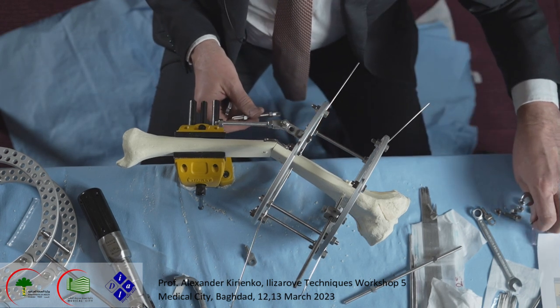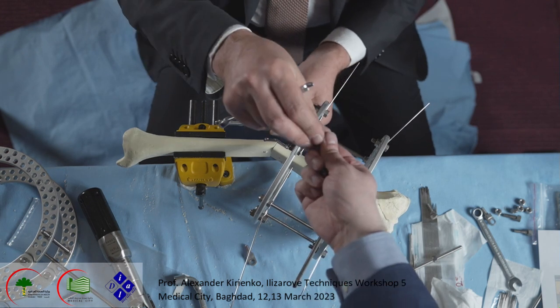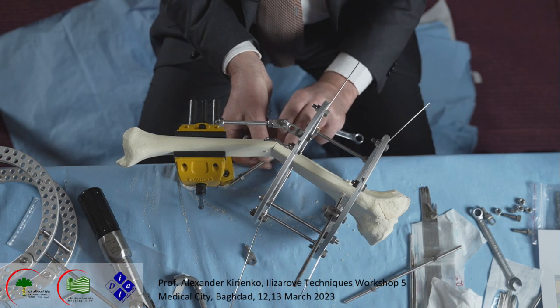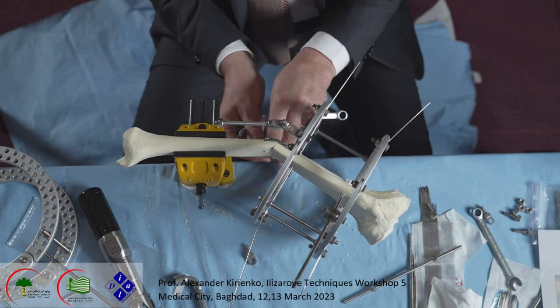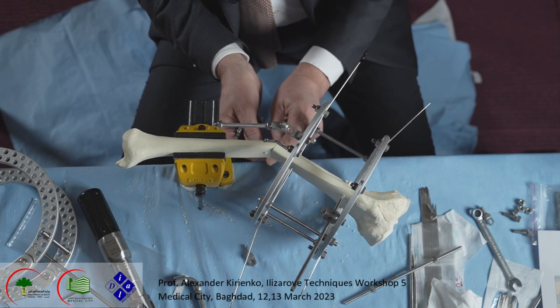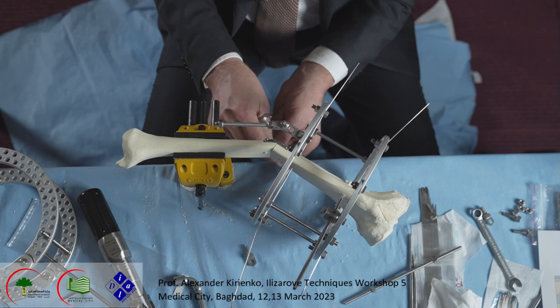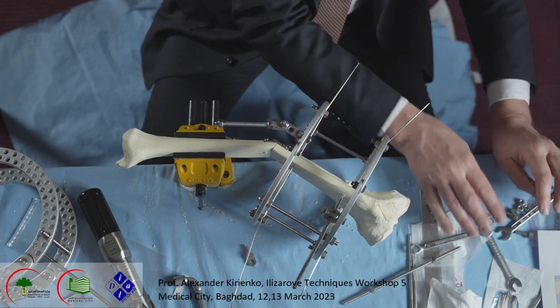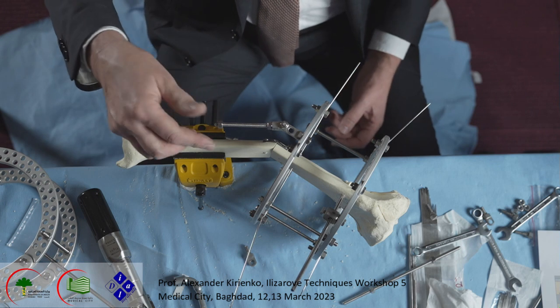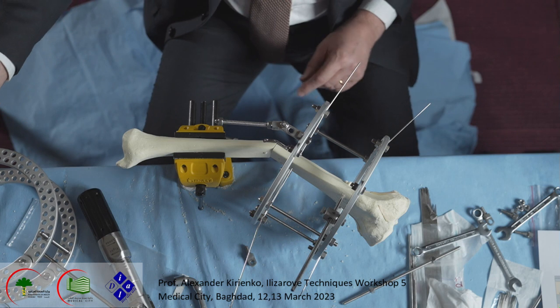Bolt. The same plane. Okay, in this rod, the direction of this rod should be parallel to the distal part of the tibia.